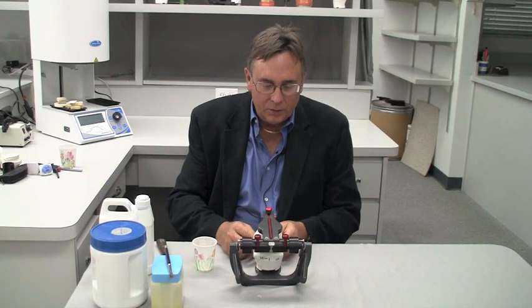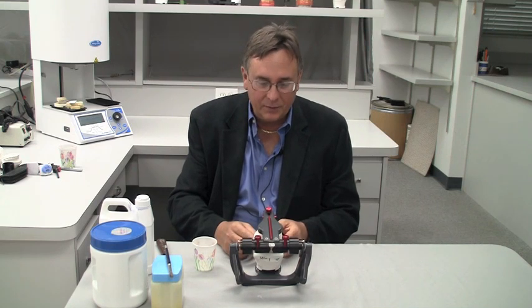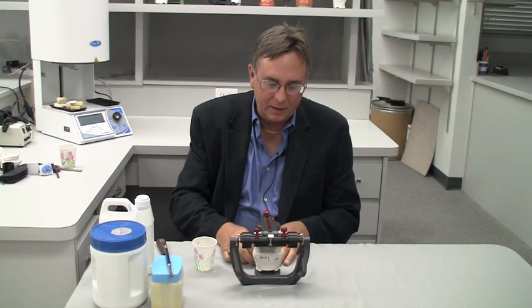Hi there. We are going to take just a moment here today to go through the really simple process to make an accurate anterior guide table on a DNR Mark 320 articulator.